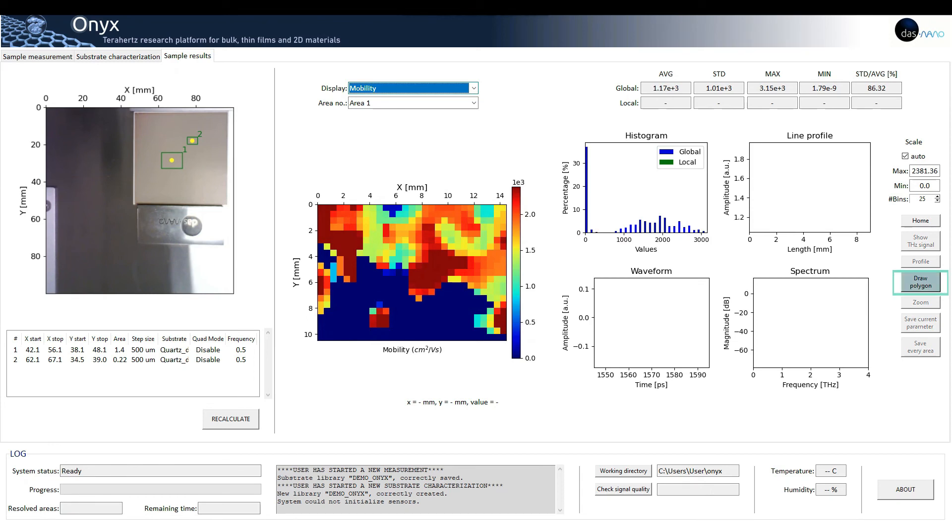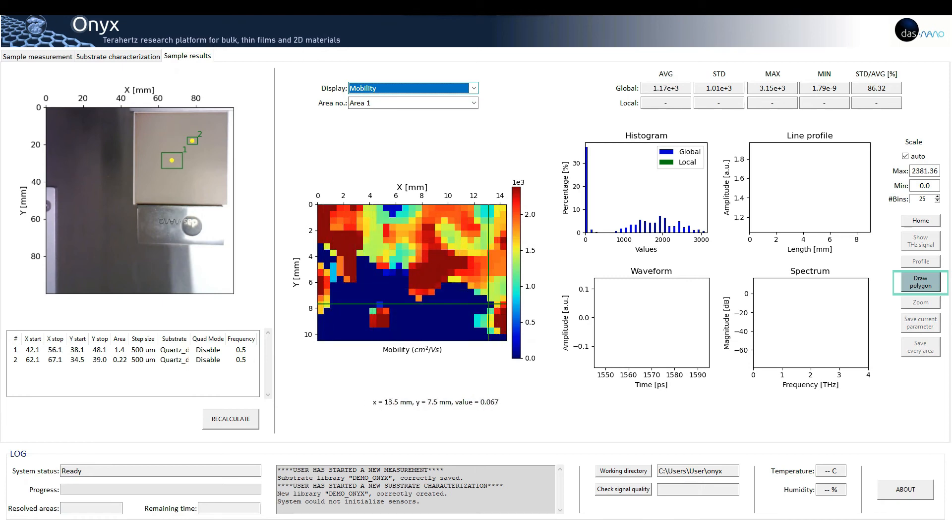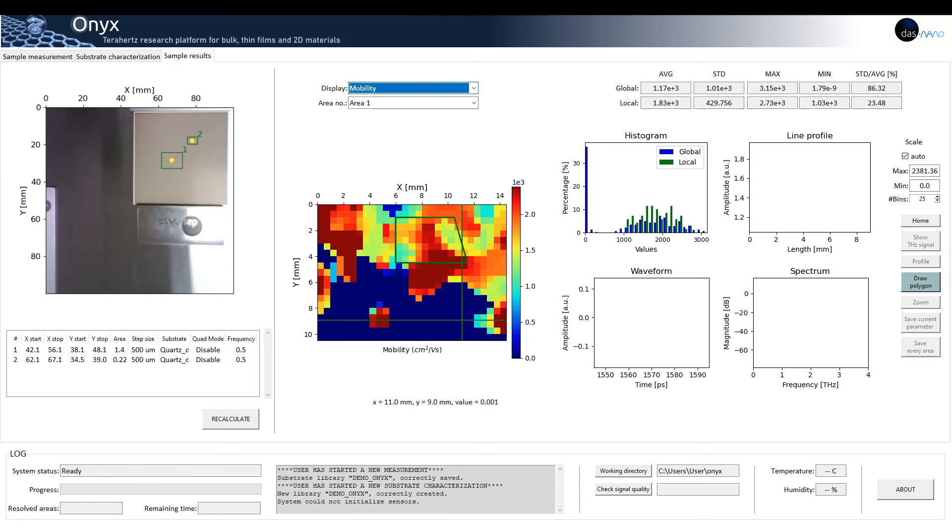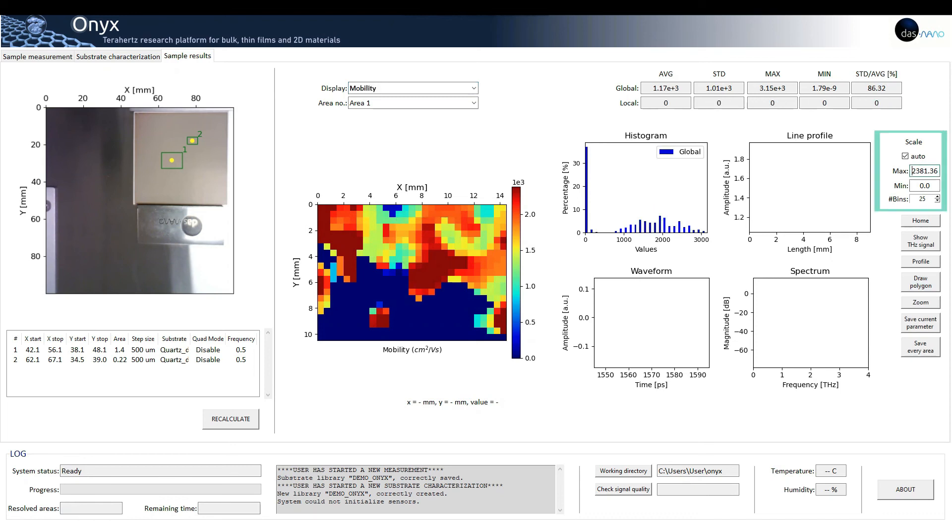The function of drawing polygon is very useful when we have very different areas of a sample, as in the case of the mobility of the sample. This allows us to individually analyze well differentiated areas of our samples.